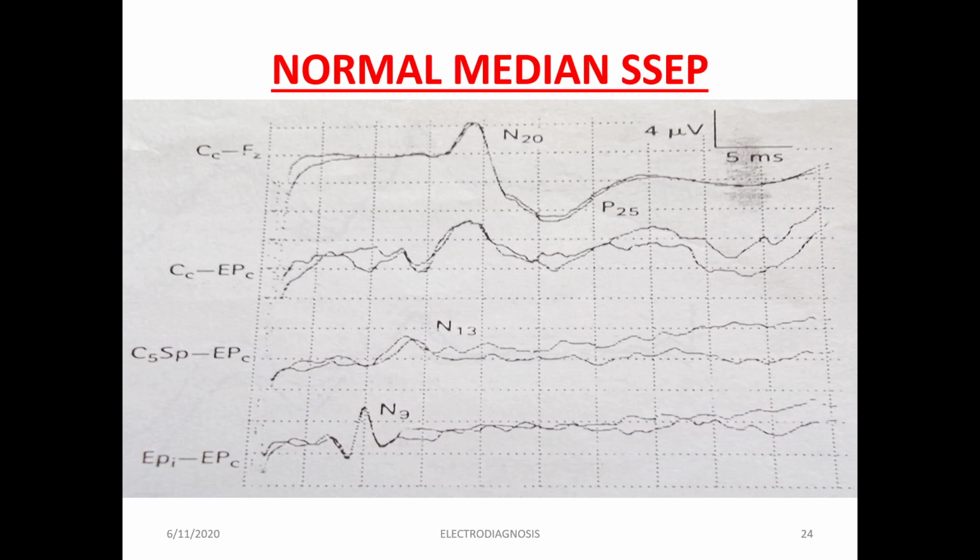Okay, so that is large square. Many times you have simply large square. So here you can see only large square. In a few graph papers you will have large square, and that one large square will have 25 small squares. So you can think of one large square. And if you don't want to fall into this confusion of large and small square, just consider 1 centimeter. Okay, so 5 millisecond is 1 centimeter.